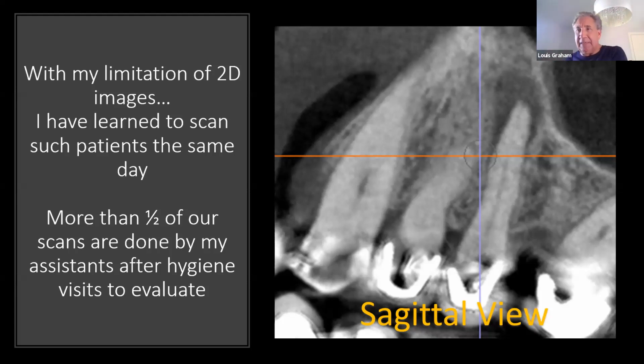So this allows me guidance because I don't want to waste my time doing endo where I don't think I'm going to do a great job. I don't want to struggle. That saves me a tremendous amount of stress. So this not only tells me I've got an abscess, I can use this to guide, am I going to treat or not treat?